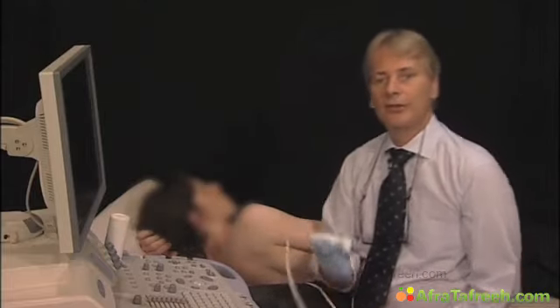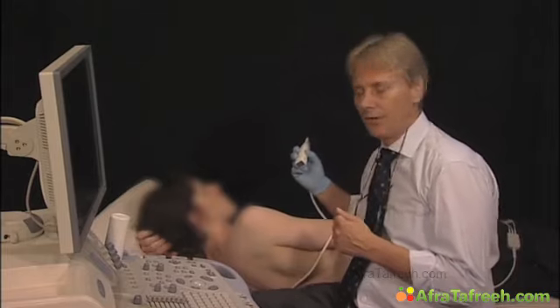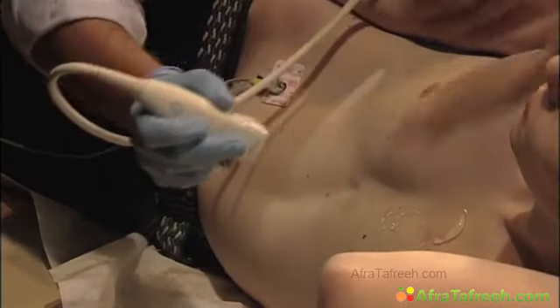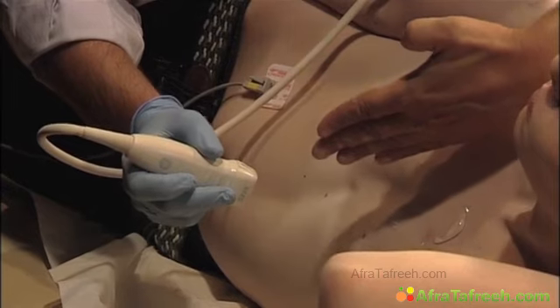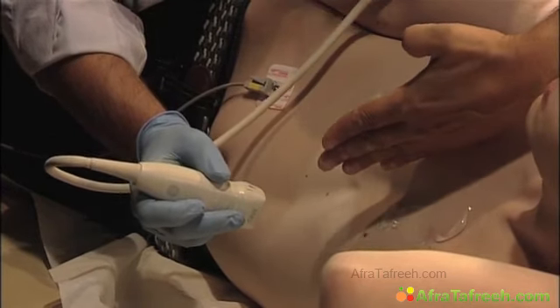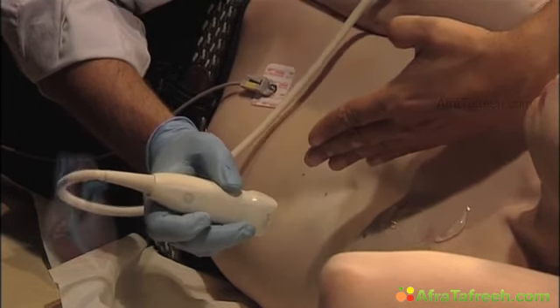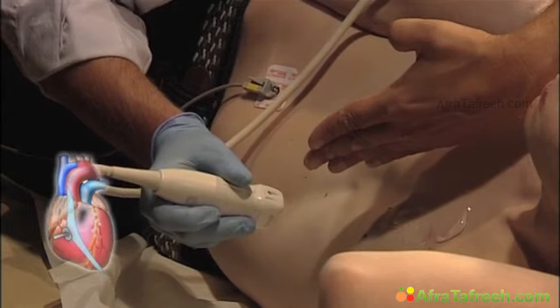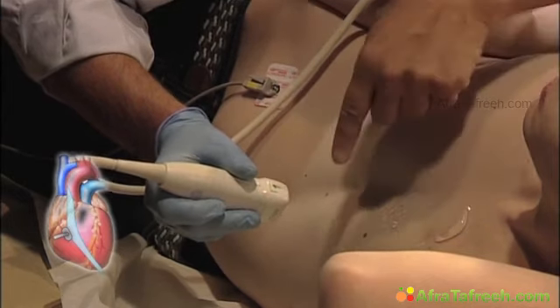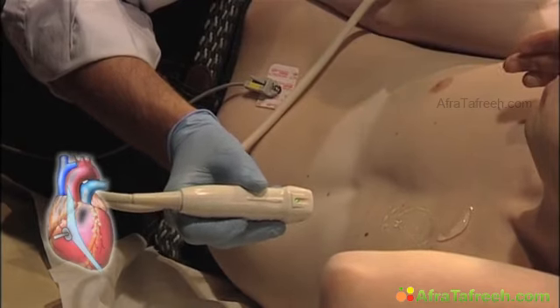To find the parasternal long axis, it is important to understand the axis of the heart. If we look at the heart, it is oriented from a right upper to a left lower position, somewhere like my hand is showing now. If you want to orient the long axis, you therefore need to point the marker of the transducer towards the right shoulder.